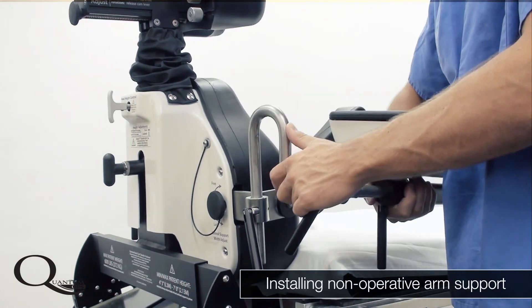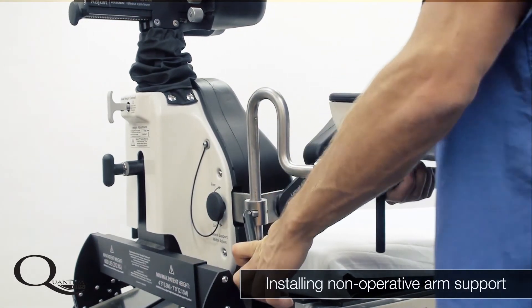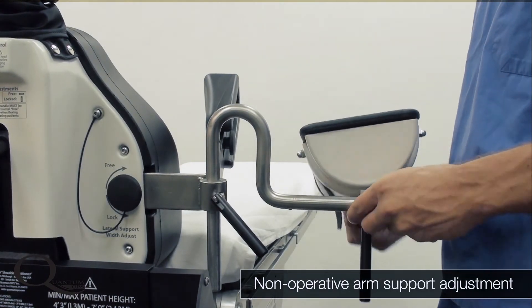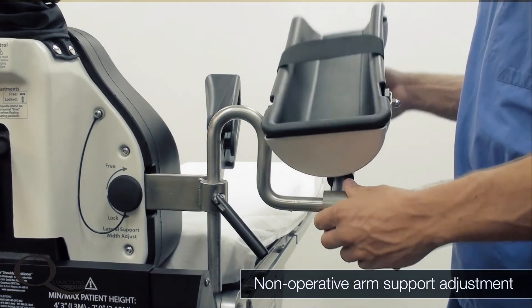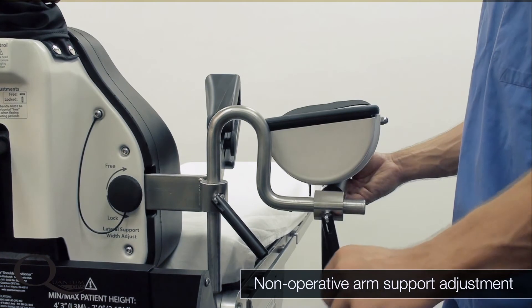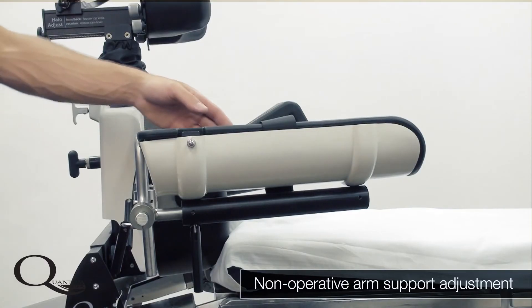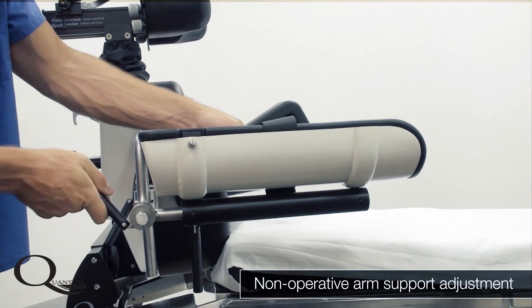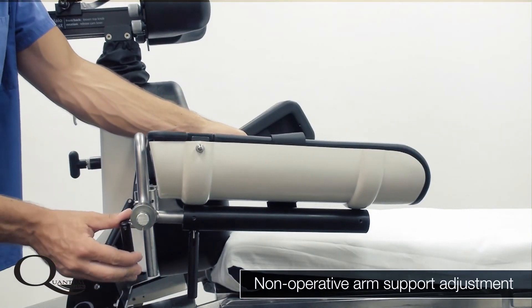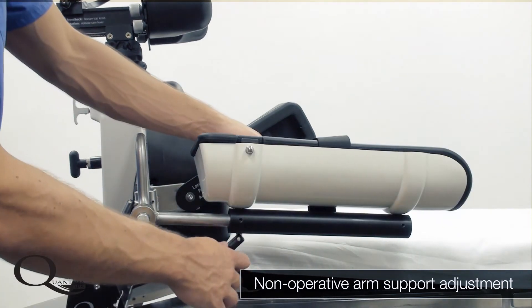The arm positioner is used to hold the non-operative arm both during the supine intubation elevation and for the duration of the shoulder procedure. It is easily installed onto the lateral supports and can be adjusted to virtually any position to accommodate any size or shape patient. Note the Velcro strap on the top of the arm holder, which helps ensure the arm does not fall back while the patient is still supine. It is important to position the arm holder so that it is not applying excessive pressure to the elbow, and so that it is rotated internally so as not to compress the ulnar nerve.